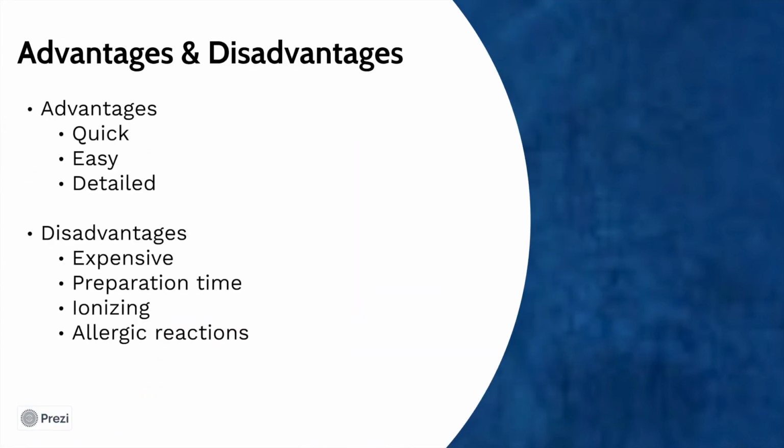The advantages of using CT is that it is really quick to use. The information you will receive will be fast. It only takes about 3 to 5 minutes for each procedure. It is really easy to use, and the information you receive from the images is very detailed.